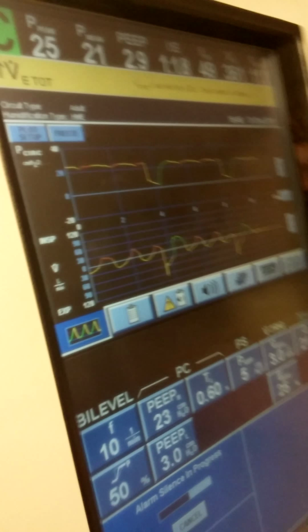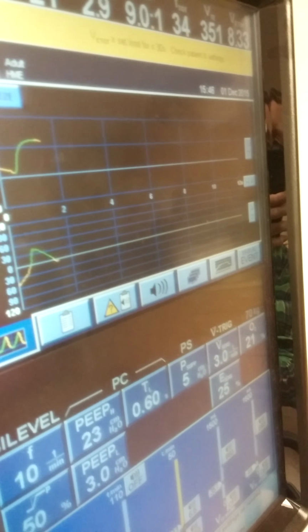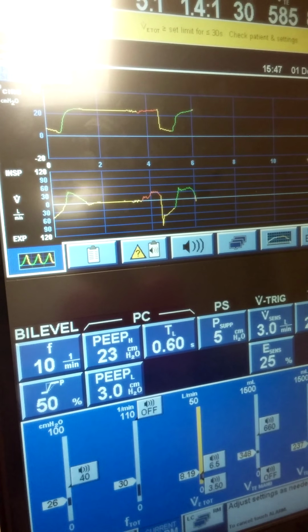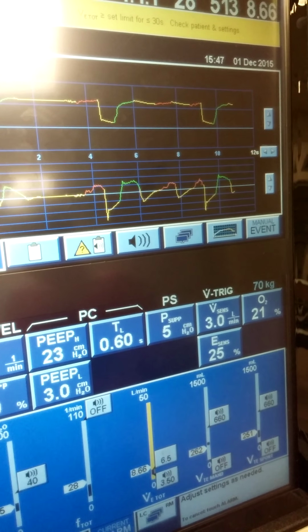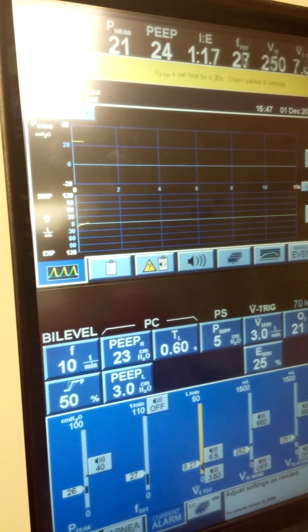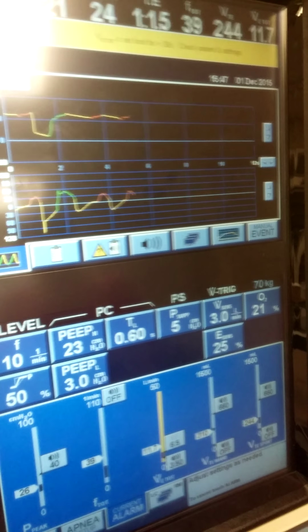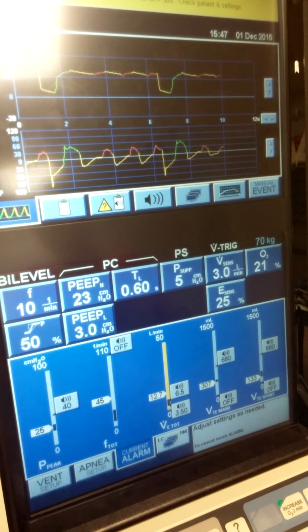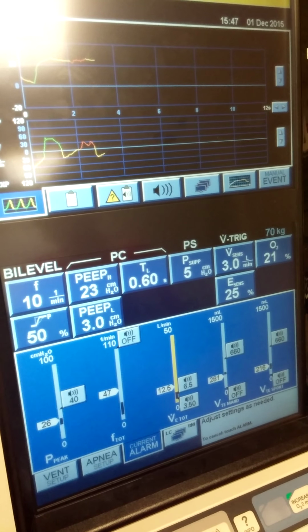Okay. So you're showing here that there are some spontaneous volumes going on. So the release, and it's being measured. During the release, it's just flushing that gas out, flushing new gas in. Patients with air trapping, you want them trapped. Right, but then with the release, they're not really air trapped as much. Yeah, because you don't want the de-recruitment. That's right. We always learn that auto peep is the devil. Here, actually, it's the savior. Yeah.